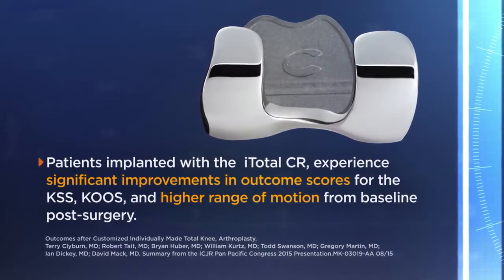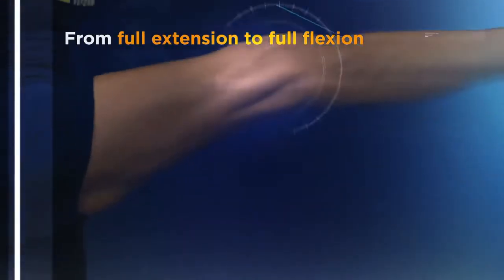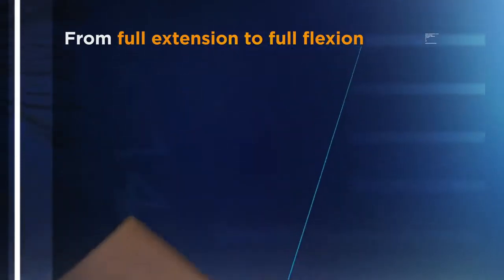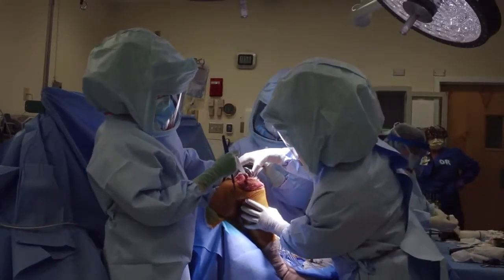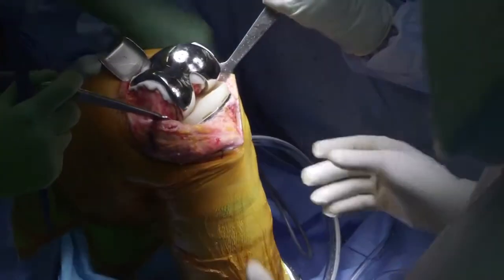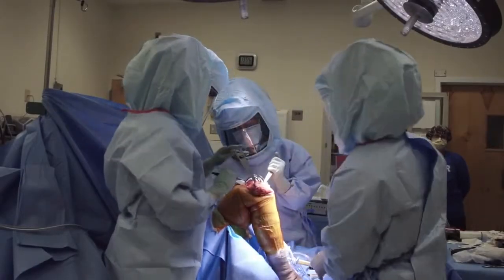Every single implant that I put in has been balanced throughout the arc of motion from full extension to full flexion. And what I would emphasize is that it doesn't matter whether it's a CR design or a PS design. They both balance the ligaments equally well. They both go in equally well. They both have the same feel. They both get the job done.